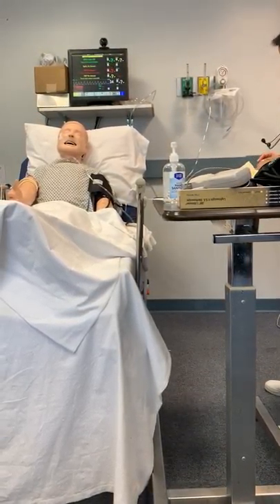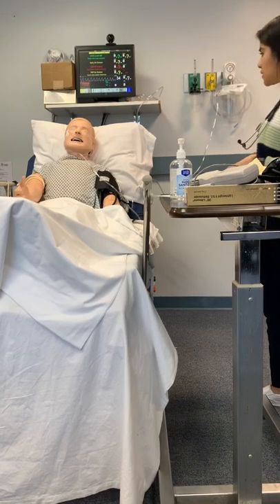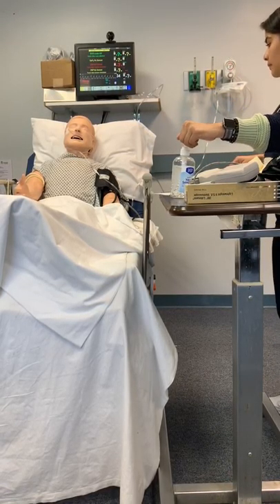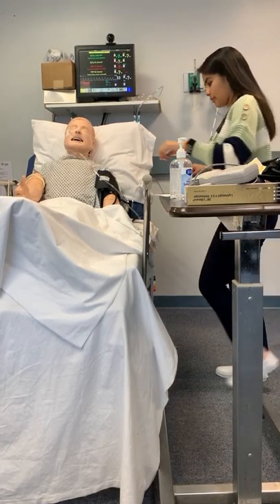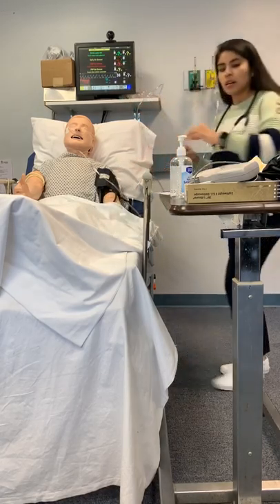Good morning. My name is Mara. I'm a respiratory care student. I'm here to take your vitals and check on your oxygen. Can you verify your name and date of birth for me? Tom Jones, 12/16/54. Perfect. I'm just going to look at your wristband.